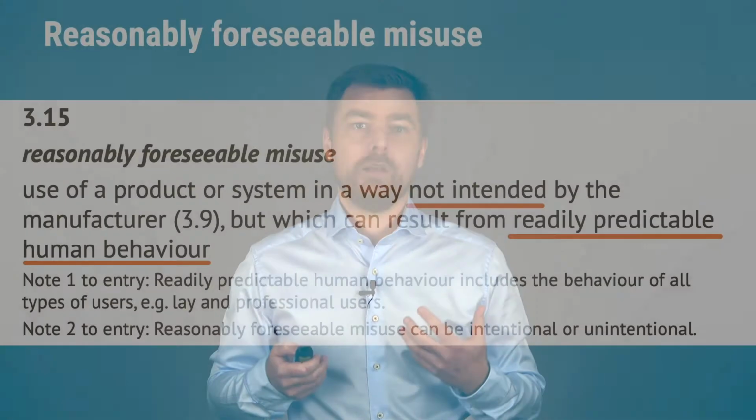Let's get started. In this video, I will introduce you to the general requirements related to safety, as defined by IEC 60601-1. Most of these requirements will be relevant to you, no matter what kind of device you're working on. You must design the device to meet these requirements in both normal use and in foreseeable misuse.